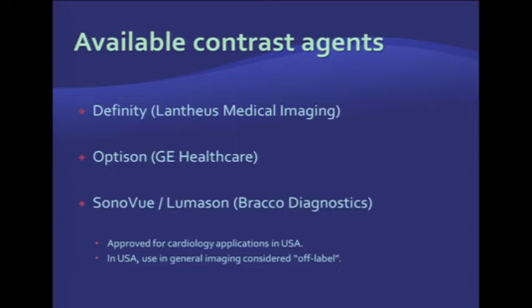Three contrast agents are available in the United States. Those are Definity, Optison, and Lumason. All of them are approved for cardiology applications, and use of contrast agents in general imaging is considered off-label.